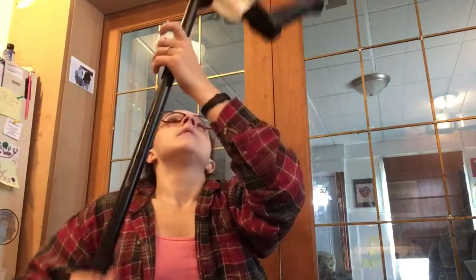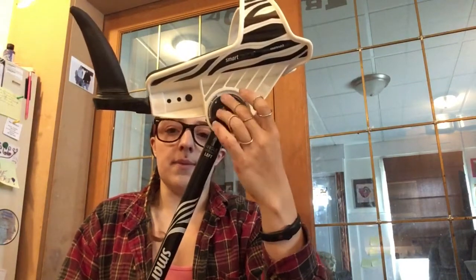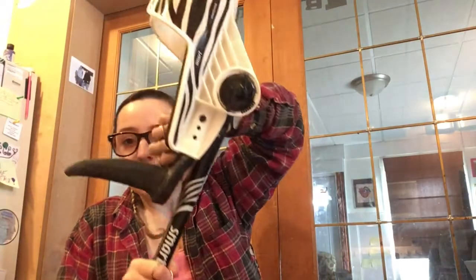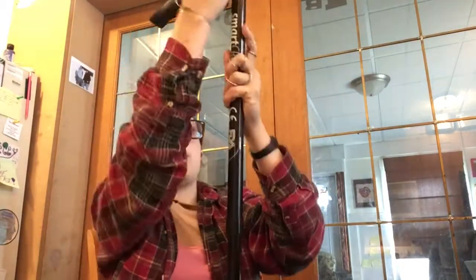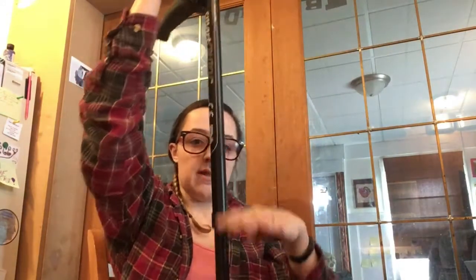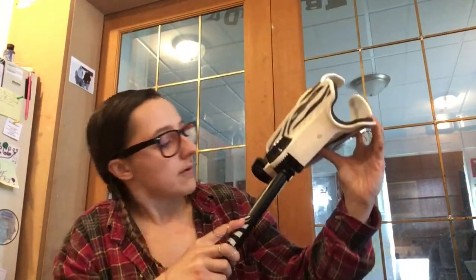This thing here is what adjusts. This is the large wing nut. You can unscrew that a bit, and then this part moves. They came in the box, shipped to me like this, with this crutch tip or leg all the way up here so that they were only about this tall. So I'm sure if you needed to fit them on an airplane or some kind of small enclosed space, like in the back of a car, they won't be bigger than, I'd say, a couple of feet, judging by the box.